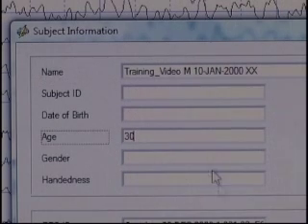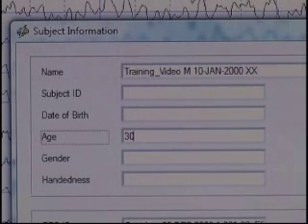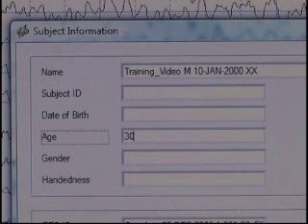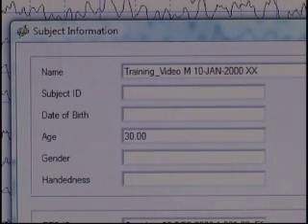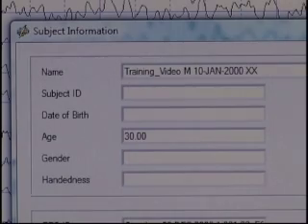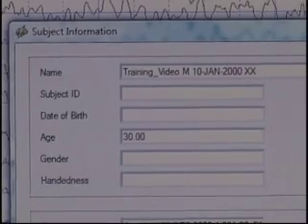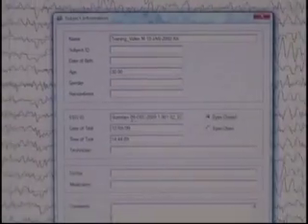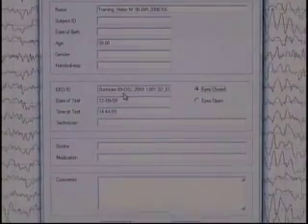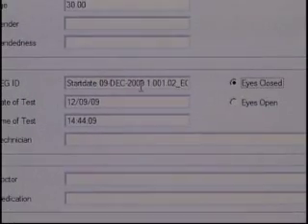Then we have the Eyes Closed or Eyes Open condition, and we're going to state that this is Eyes Closed. We even see that in the EEG ID, Eyes Closed. We see the date of the recording here, December 9, 2009.